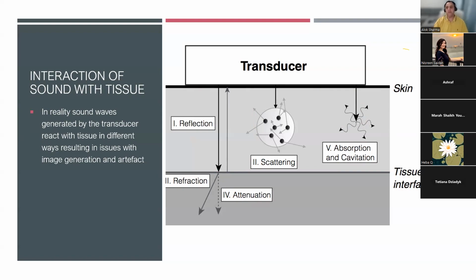Now, just remember, and again, I want you to look at my chest. If my probe is kept perpendicular, it's easy to do at the anterior part of my chest, because it's a flat surface. But when I keep my probe in the lateral part, this is not a flat surface. This is an angulated surface. So to see the right or the left upper lobe of the lung through a lateral margin, keeping it perpendicular is going to be quite tricky. And that's why it's so important.